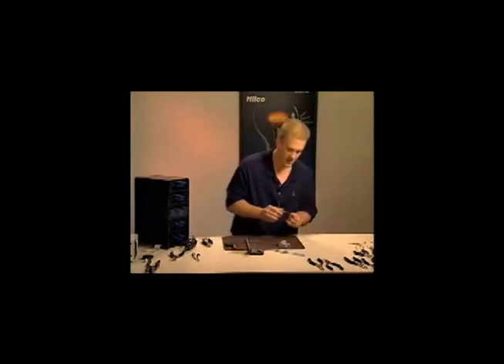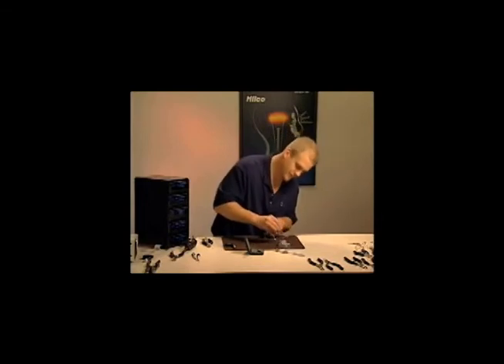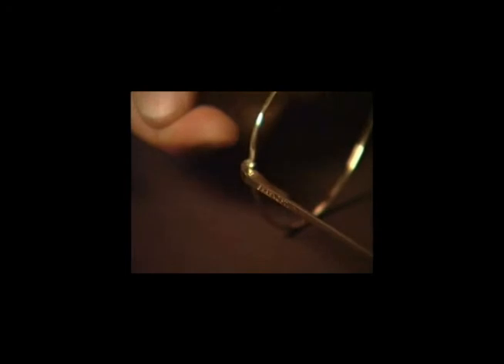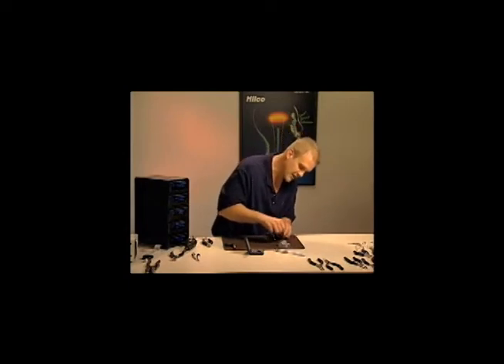So here we have a frame where we're going to drill out the screw in the eye wire. So I'm going to take the device. Now, the eye wire screw goes up from the bottom, so the head of the screw is down below. So I want to drill the screw from the top of the frame, but it's actually the bottom of the screw. So I'm going to clamp down this device.